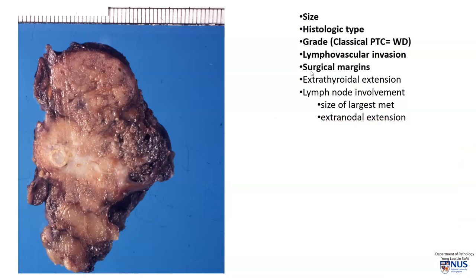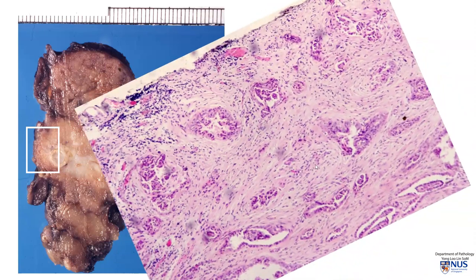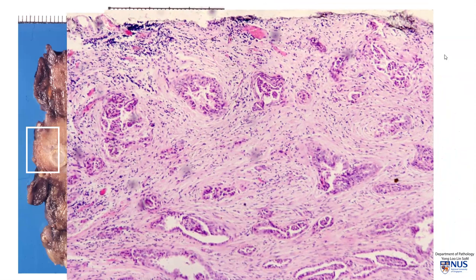The next thing we want to assess is surgical margins. I'm most concerned about this area because I can see the tumor is really close to the margin here. So I'll take a sample from there, and we can see that the tumor just touches on the surgical margin, and therefore the margin is involved focally.